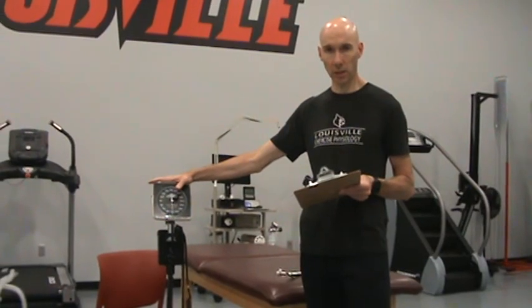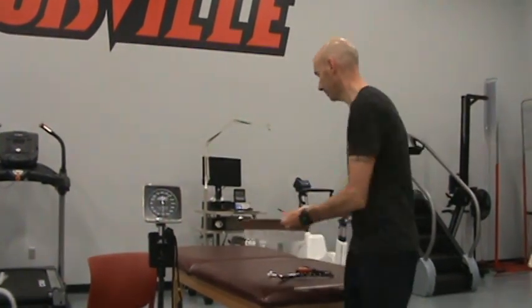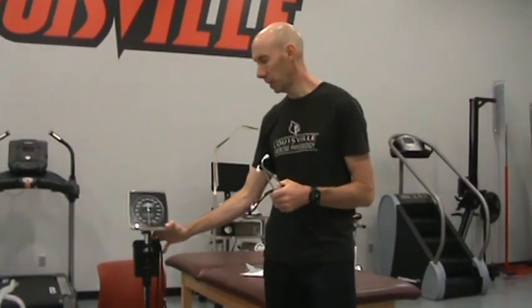Before we actually take any measurements, I wanted to introduce the sphygmomanometer. That's one of the most favorite words in all of exercise physiology and health, more commonly known as a blood pressure device. You will need a stethoscope when you use this as well. So I'm going to go through the basic procedure of how to use this device first without the subject, and then we'll bring Lindsay in and start actually taking some measurements.